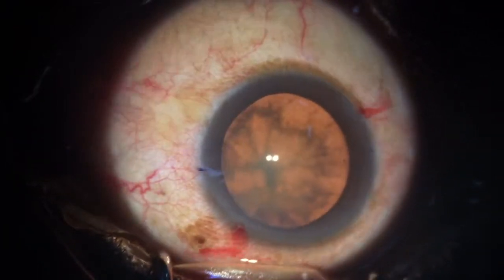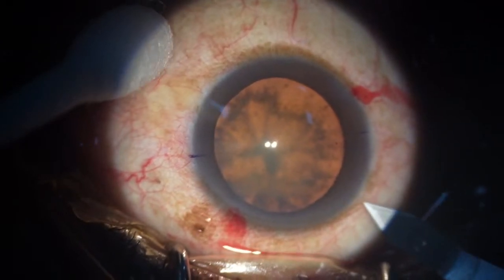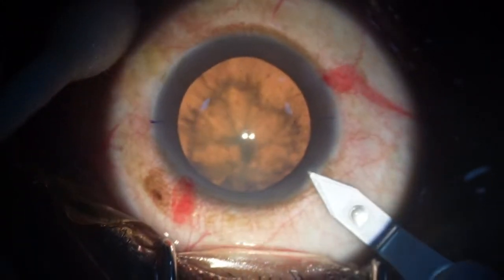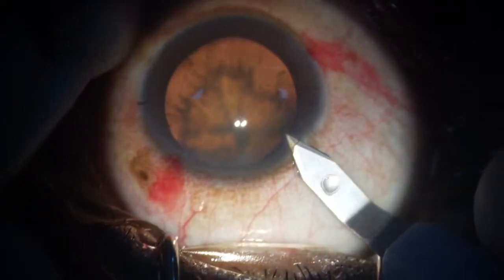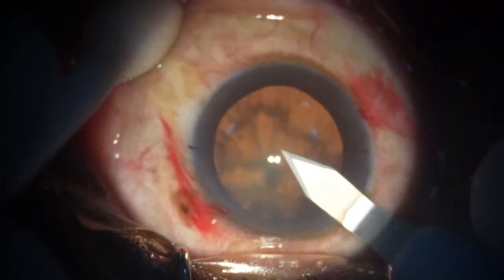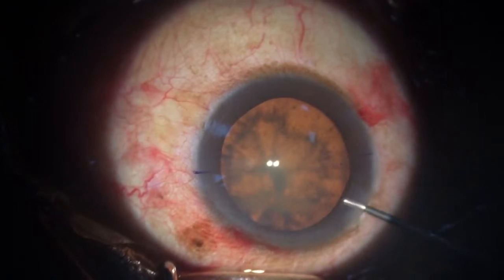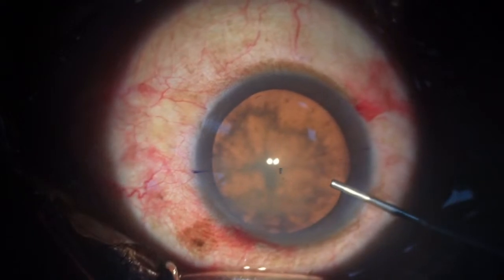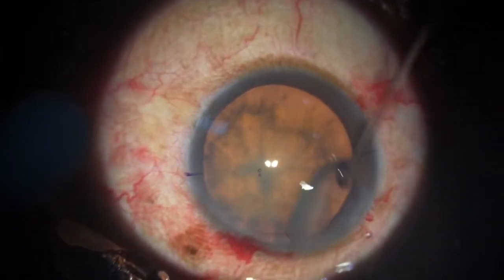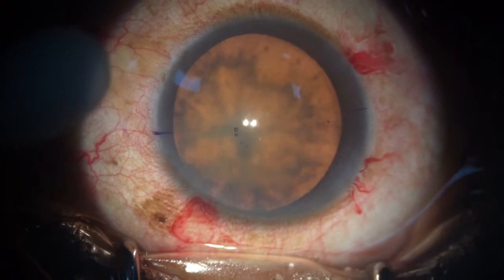Yes, 0.1 I use for my calculation. I used to use 0.3 like about 7, 8 years back. Then Dr. Barrett convinced me that if my incision is 2.2, I should not be using 0.3. And that made a huge difference to my results also. So I'm using a 2.2 incision. And of course, the center's arrangements are impeccable. Dr. Raghav is looking after in the absence of Dr. Maipal today and doing a great job.